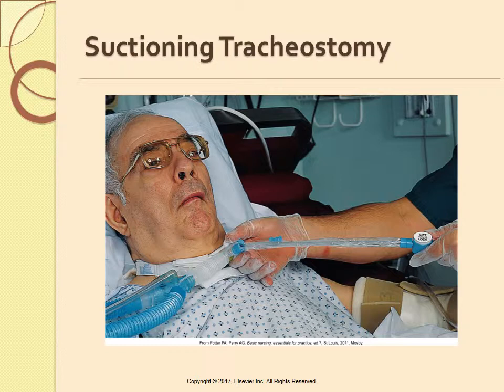If a patient is on a ventilator, the use of a closed system suction catheter is preferred in order to minimize breaks in the system and decrease the risk of ventilator-associated pneumonia. Non-sterile gloves are worn during the suctioning procedure, as sterility of the suction catheter is maintained with a closed system.